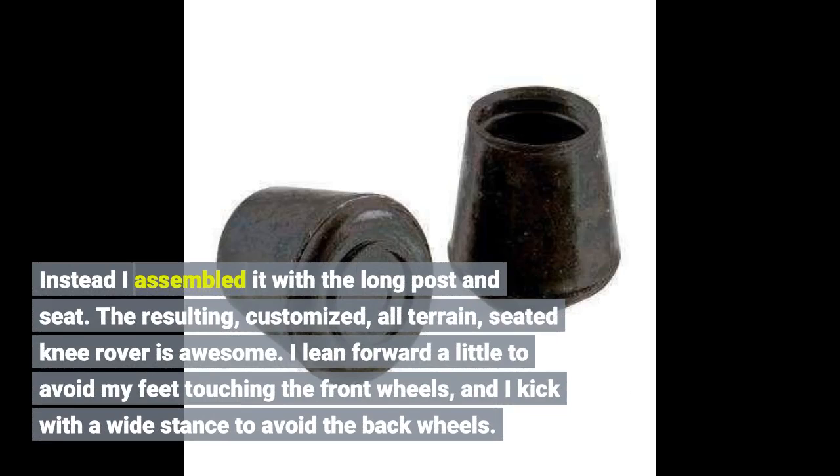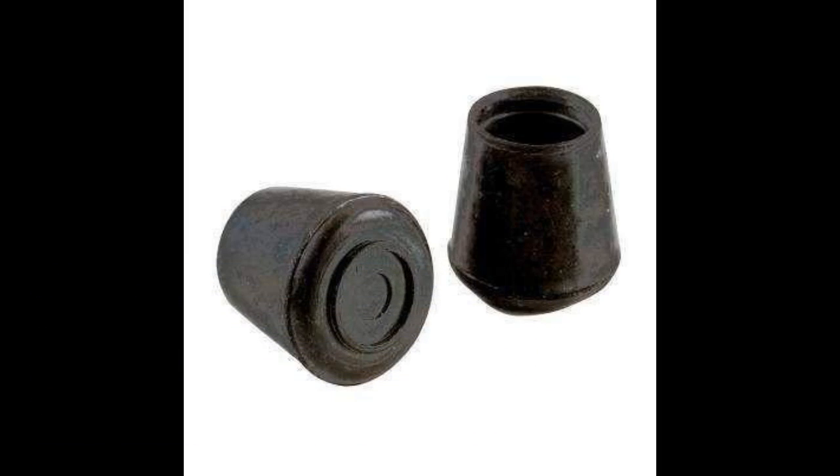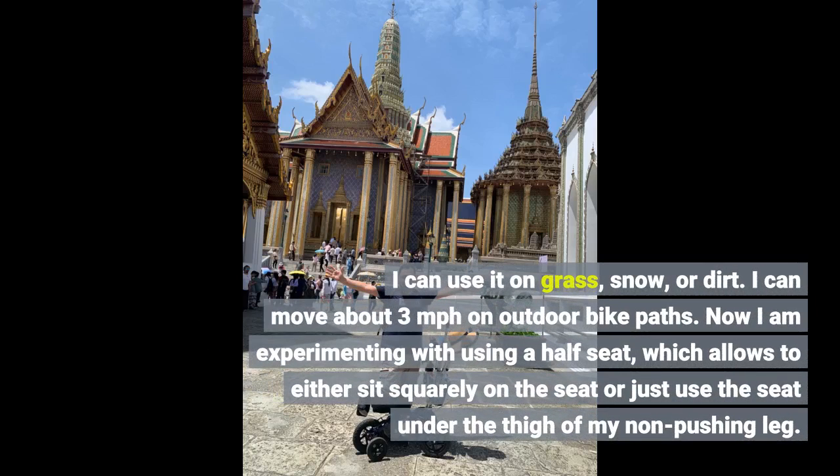Instead, I assembled it with the long post and seat. The resulting customized all-terrain seated Nirover is awesome. I lean forward a little to avoid my feet touching the front wheels and I kick with a wide stance to avoid the back wheels. I can use it on grass, snow, or dirt, and I can move about 3 miles per hour on outdoor bike paths.